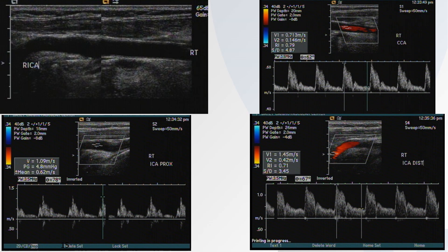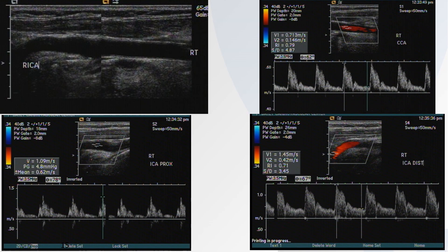How about another one? In the upper left we see a composite image of the right common and internal carotid artery. Upper right shows a spectrum from the distal right common carotid, lower left from the right proximal common, and lower right from a bit more distal in the right ICA. So what's the percent diameter reduction in the ICA? Zero percent? Less than 50? Greater than 50? Greater than 80? Don't know for sure — you've got to commit.